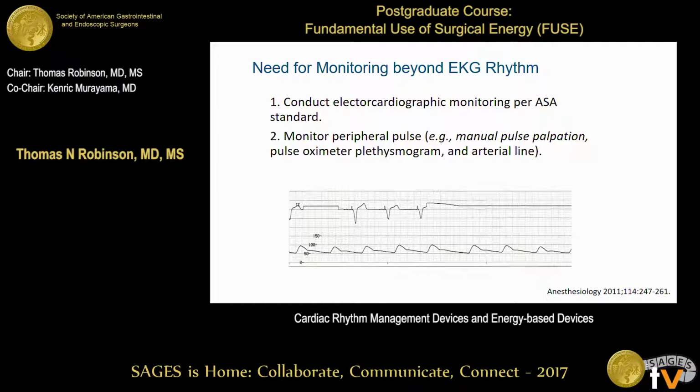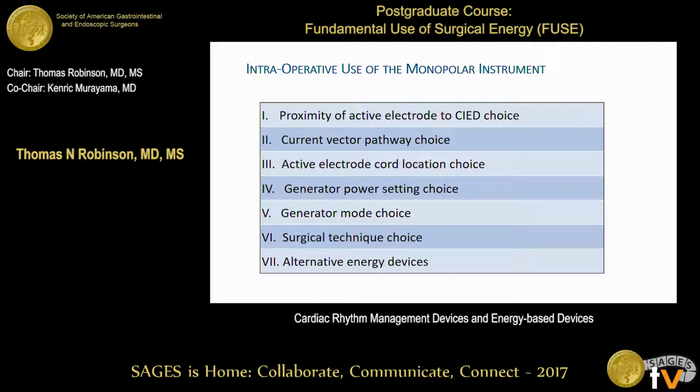Then my final section here is simply, when you're in the operating room, what are the things that you can do as a surgeon that are going to minimize the amount of electromagnetic interference or the disruption of this electronic device that's implanted in the patient?